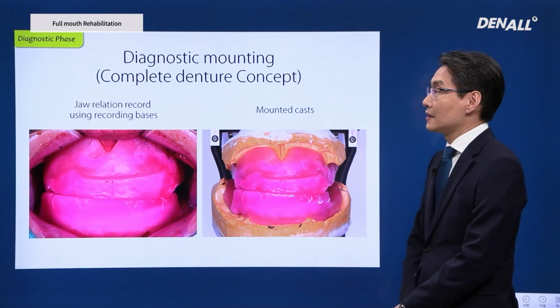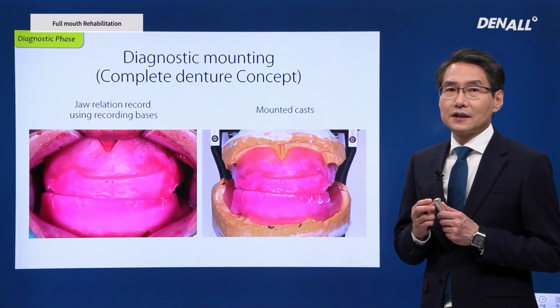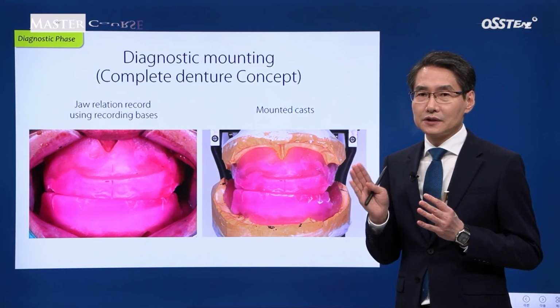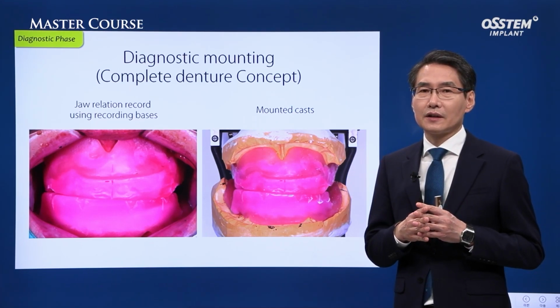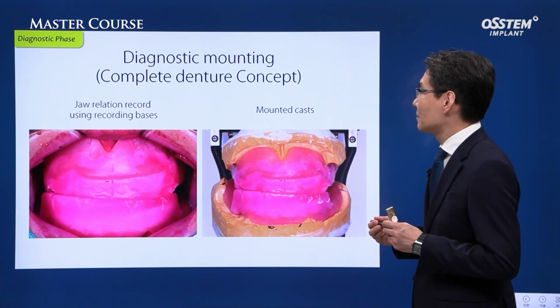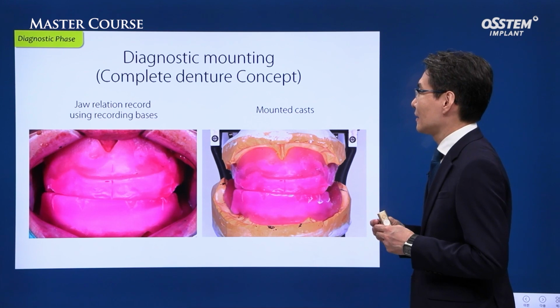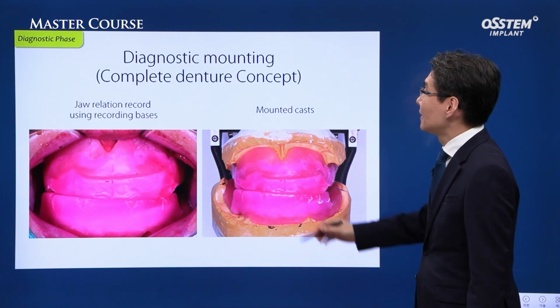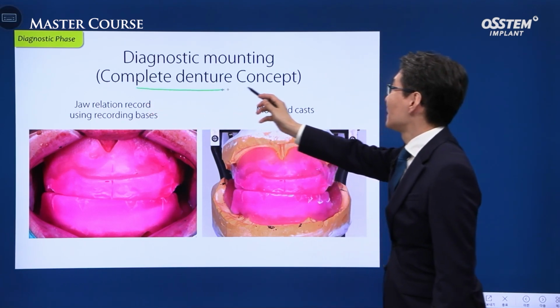This is diagnostic phase. There are different ways to do diagnosis for fully edentulous cases. You can use analog method or you can utilize digital method. In my case, I thought conventional method would suit me better, so I still use this method frequently. This is complete denture concept.